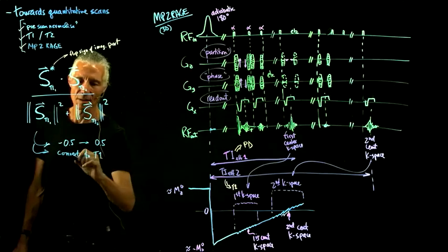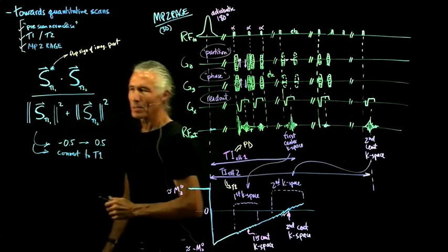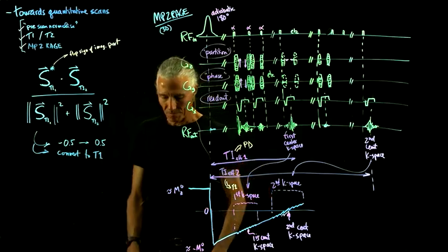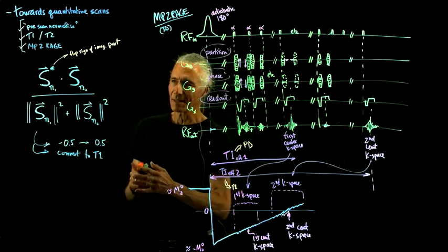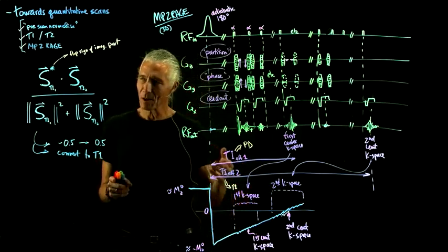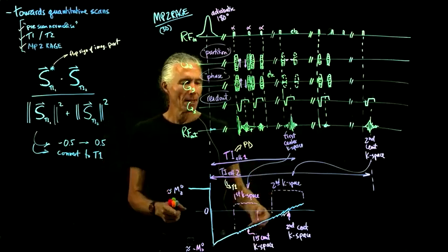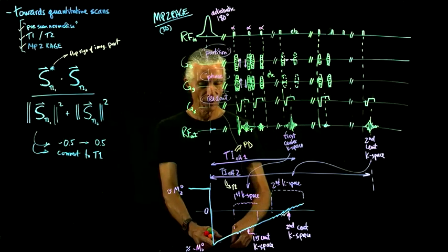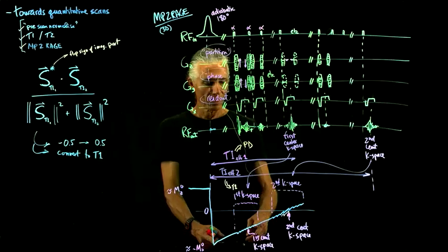So you need a little bit of extra math, but you could convert it to an actual T1. And we have this on the scanner if you want to play with this one. It doesn't take very much longer than a regular MP RAGE, because in a regular MP RAGE, you'd wait longer before you started recording for some recovery.